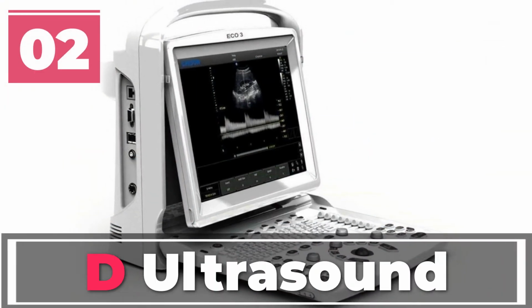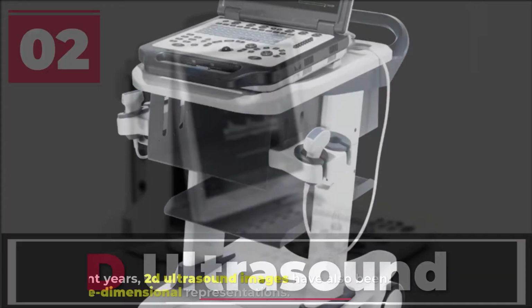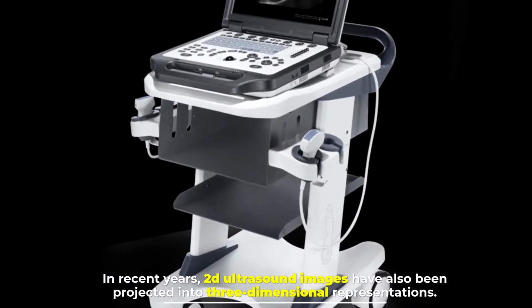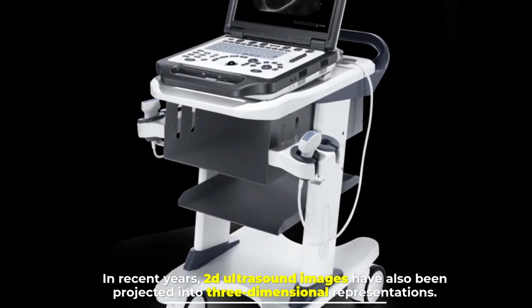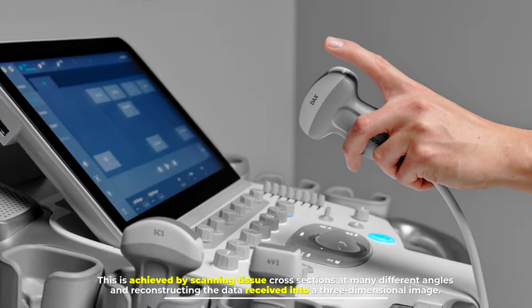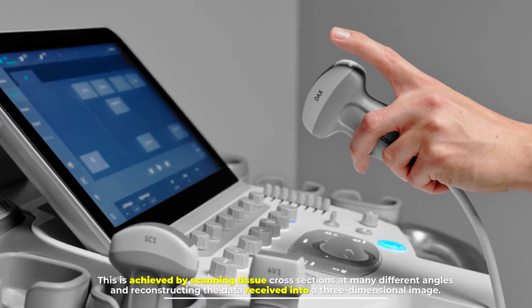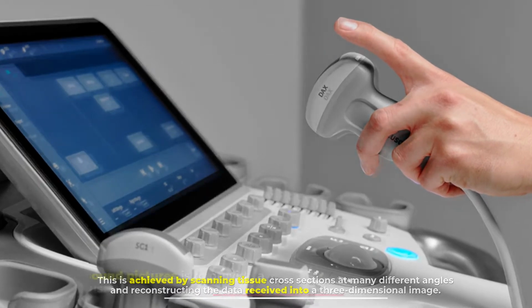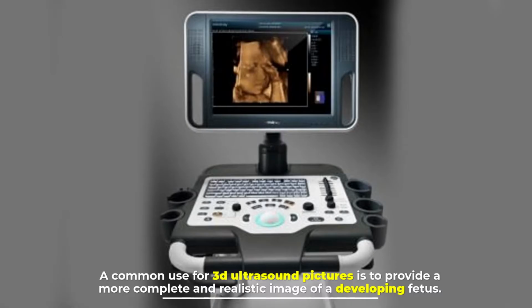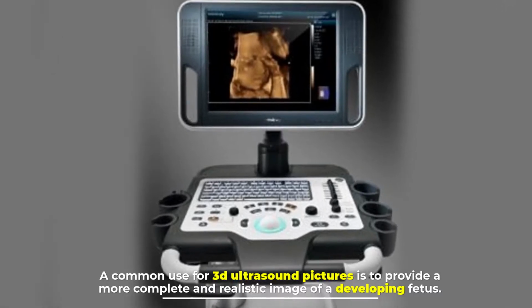Number 2. 3D ultrasound. In recent years, 2D ultrasound images have also been projected into three-dimensional representations. This is achieved by scanning tissue cross-sections at many different angles and reconstructing the data received into a three-dimensional image. A common use for 3D ultrasound pictures is to provide a more complete and realistic image of a developing fetus.